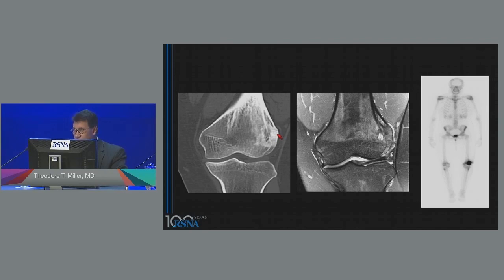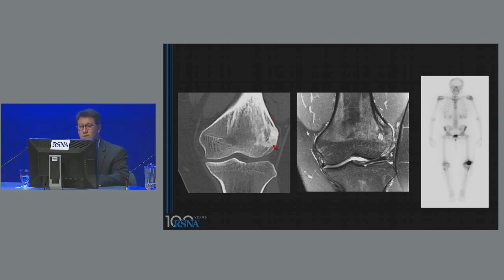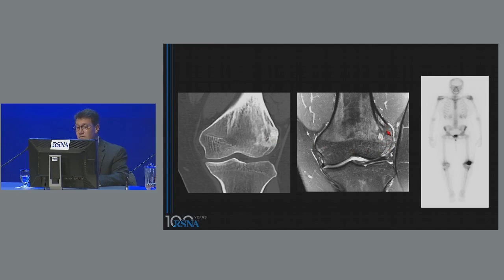But there were some other findings here that I wasn't really sure what to do with. First of all, I had a lot of problems trying to figure out — was this actually part of the original femur, or is this all tumor-new bone formation? There is sclerosis here in the femur, and then there's this little area of trabecular rarefaction that we see here on the coronal T2. For that area that looks like trabecular bone, I actually think it may be tumor-new bone formation.